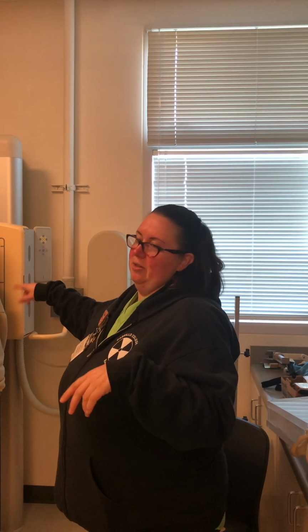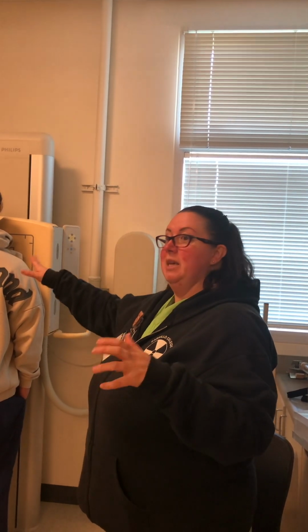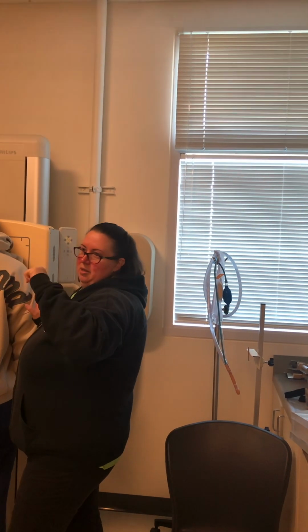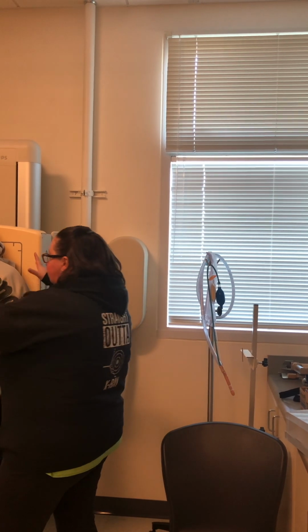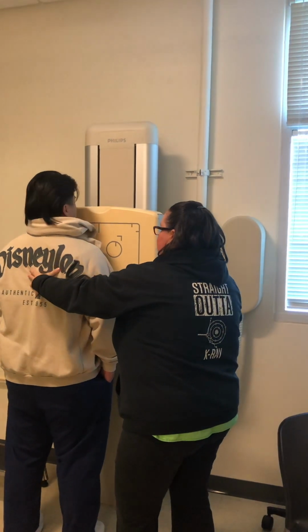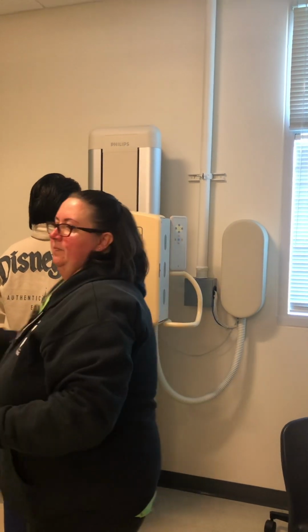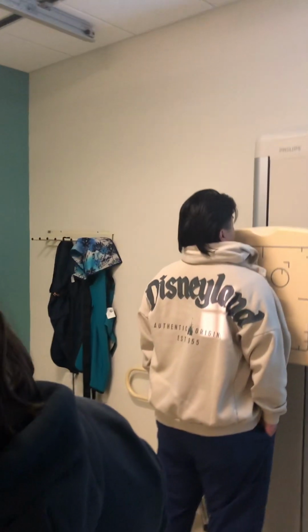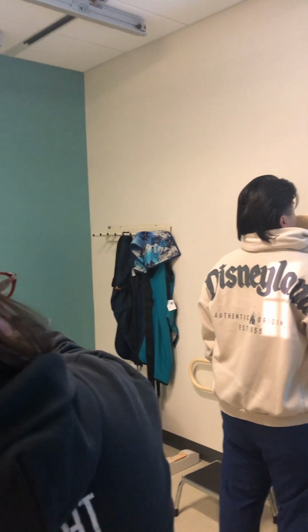Okay. So remember that when we shift to the ribs, we are going to do this, like I said, by injury. Okay? So since he's already facing the board, I'm going to do anterior injuries first, because those are going to be PA projections. And then an LAO or an RAO, but remember those are the opposites from the side that's injured. So I'm going to start with the right side, so shift a little bit to your left, nice and straight. Okay. So I'm going to come down my centering a little bit.